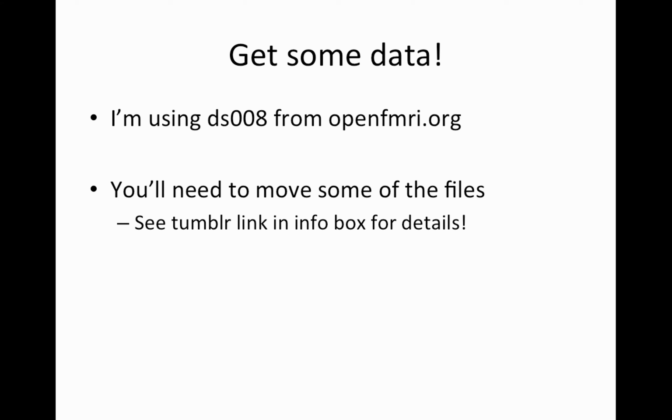And for the rest of you, if this is your first time ever analyzing any fMRI data, I highly recommend, if you have the time, just using some open fMRI data instead of your actual data. For one, if you screw up, if you delete a file or something, you can just retrieve the files again and start from scratch. Also, any weirdness in the data I will discover before you and let you know, and I doubt there's any weirdness because the data have been analyzed before.